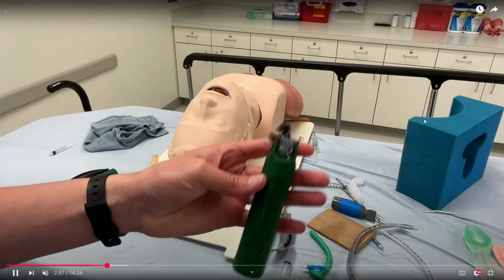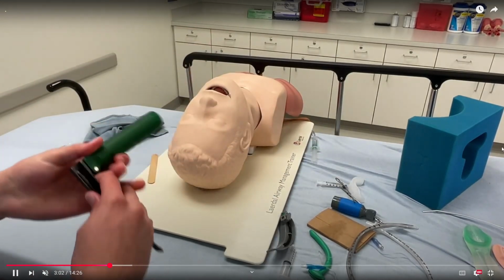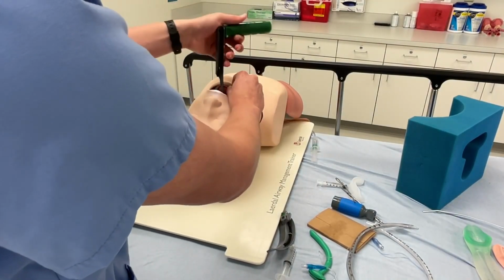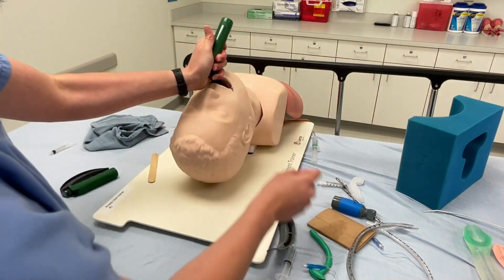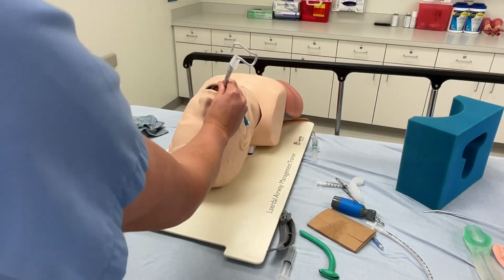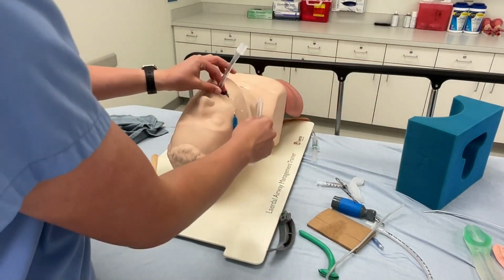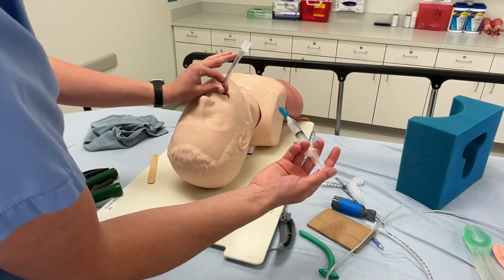Now for the Miller blade. So if you remember, the Mac was curved. Miller is straight. Similar technique. Scissor the jaw open, insert the blade. Again, very awkward due to my outstretched arms because I have to have an angle to film in. Inserting the tube, getting it firmly in there, holding tight up against the jaw, removing the stylet, and once again moving to inflate the tracheal cuff. And this one, I don't check the bounce, I just go for it.